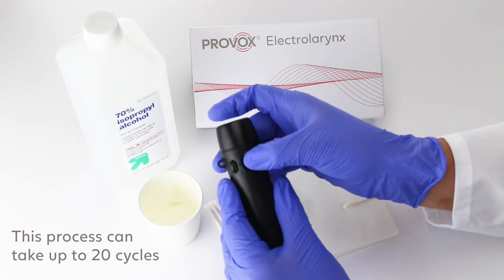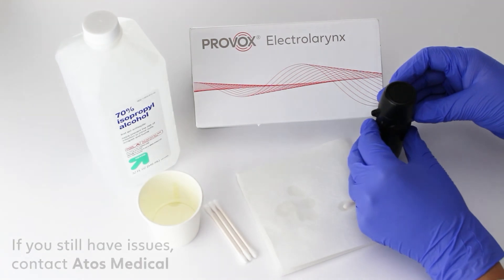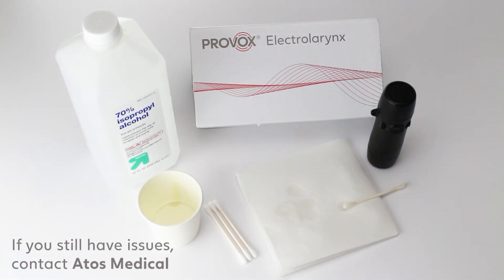This process can take up to twenty cycles. If you're still experiencing issues with your sticking power button, please contact ATOS Medical.